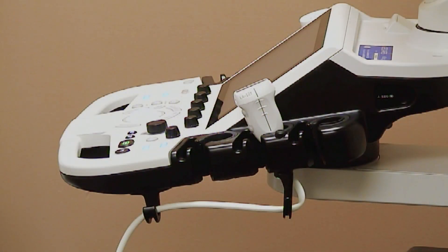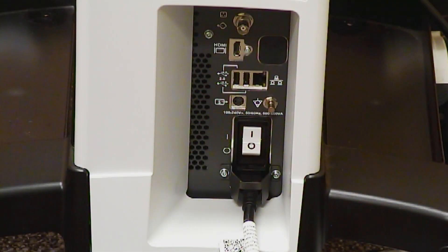Below the operator panel, you can find hooks for cord management. On the back of the P9, there is an HDMI port, two USB ports, an ethernet port, an S video connector, as well as a circuit breaker and the power cord.